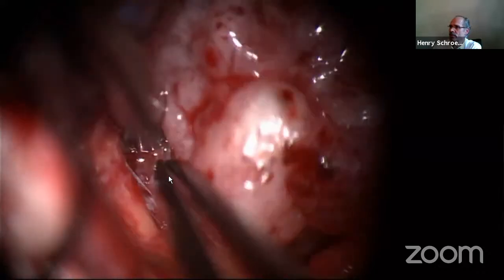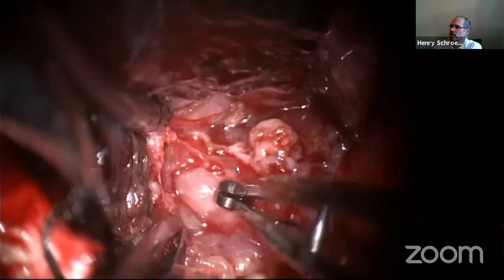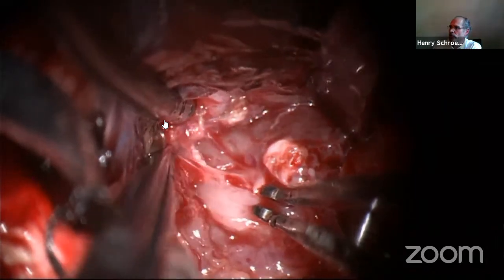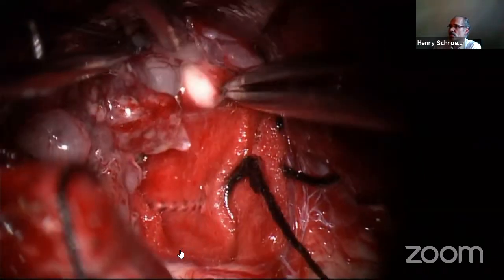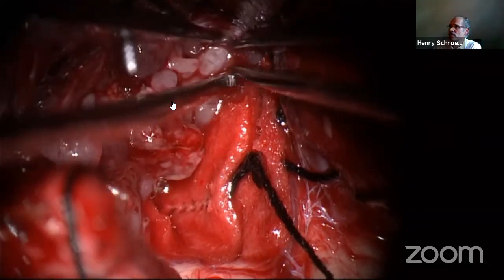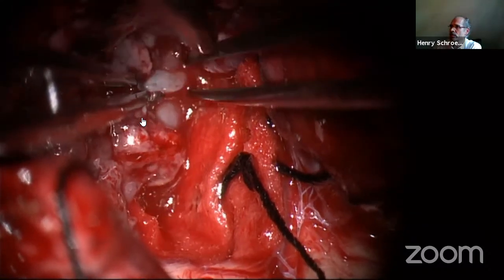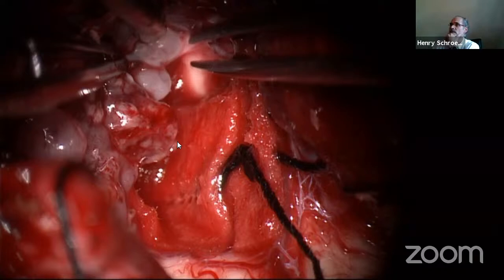This is a small perforator here from the brainstem. You have dissected carefully. And here's a forehand suction irrigation technique. So I have my tumor forceps, and with the left hand, I dissect here the arachnoid plane away from the tumor. My assistant has a suction, and here is the syringe. Here again, you see this is a suction. Tumor is adherent, lateral, but not at the floor. So with a traction, counter traction technique, carefully, millimeter by millimeter, the tumor is dissected from the brain tissue.